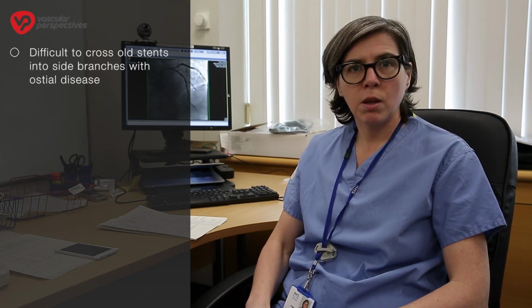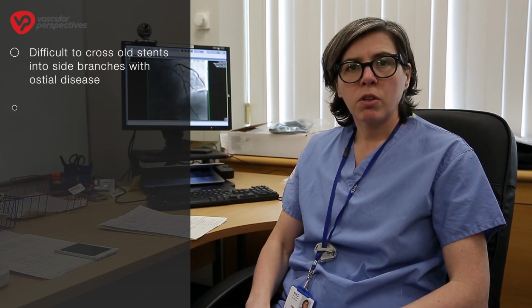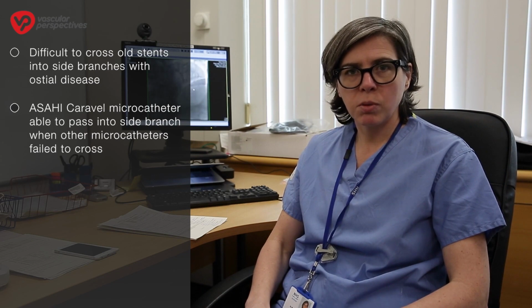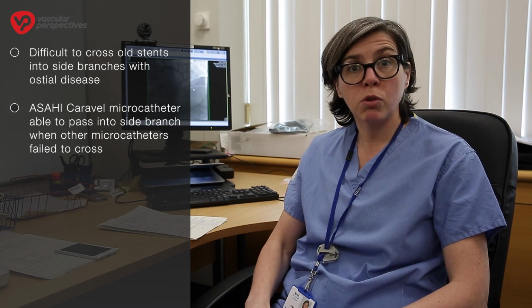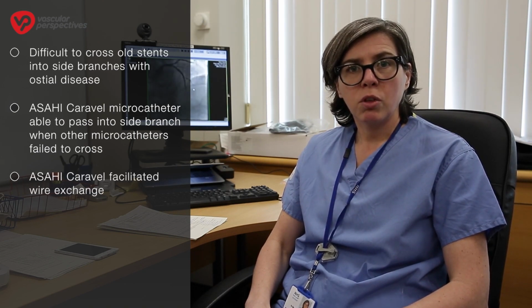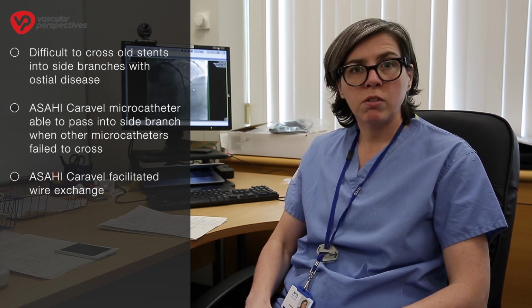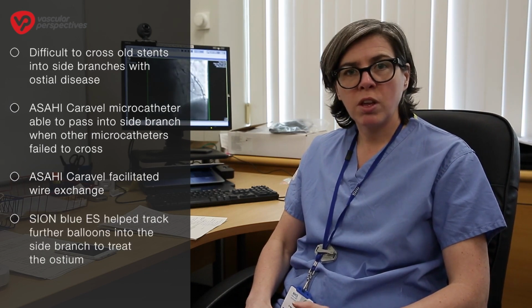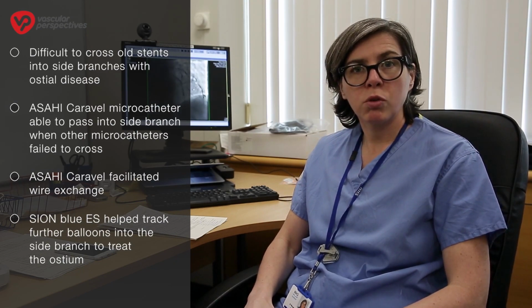So my main comments about this case are that it's often difficult to cross old stents into side branches, particularly with ostial disease, as in this case. I think that the Caravel microcatheter was very useful in this case because it was able to slide with its low profile into the side branch when the other microcatheters were unable to cross. Having delivered the microcatheter, it then allowed me to take out the penetrative Gaia wire, which is dangerous in that type of position, and exchange it for the safety of the Sion Blue Extra Support, which then also allowed me to track further balloons into the side branch and treat the ostium and restore TIMI 3 flow.